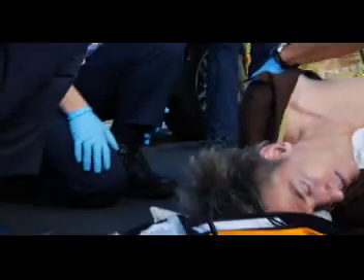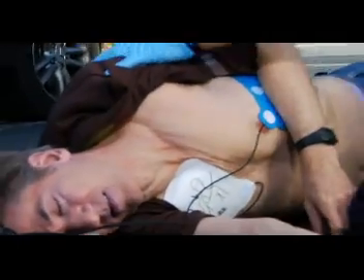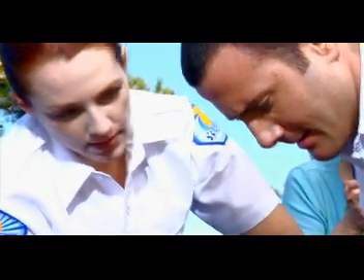He's moving. Oh, thank God. Now it's your turn to practice using the AED. Work on coordinating CPR and AED use, practice pad placement, clearing the patient, and troubleshooting AED problems.